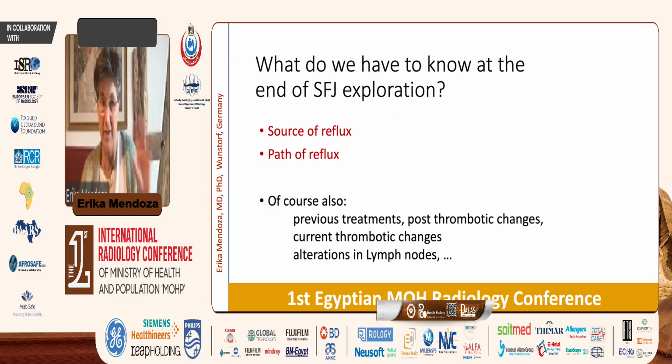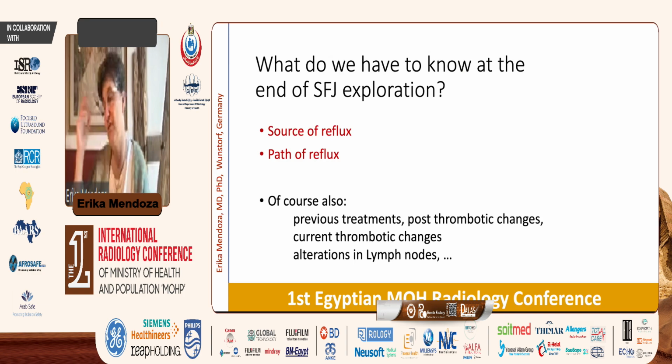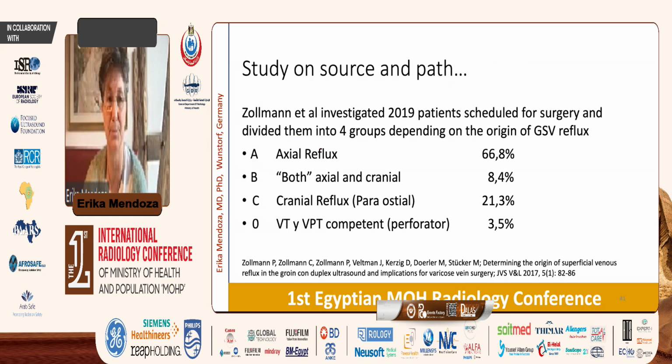Well, I've said at the end of the saphenofemoral junction, you have to know the source of reflux, the path of the reflux. And of course, you have to see if there are lymph nodes there, if there are current or older thrombotic changes, if there has been previous treatment, and so on. This is, of course, another path you have to be aware of.